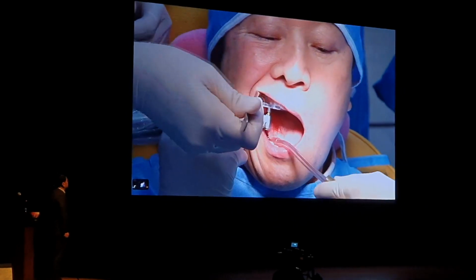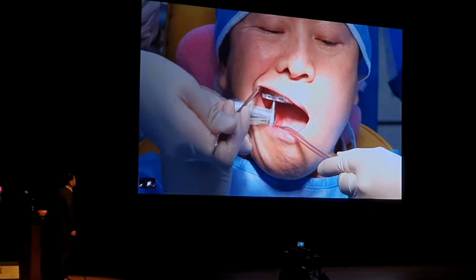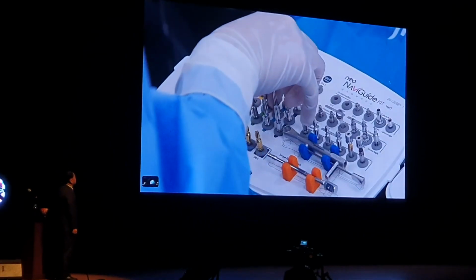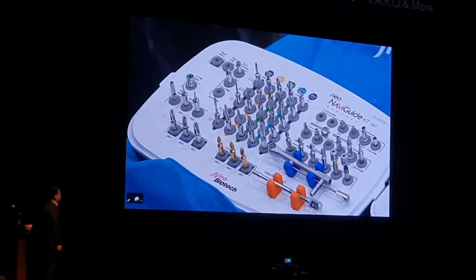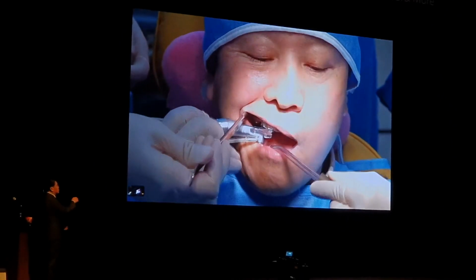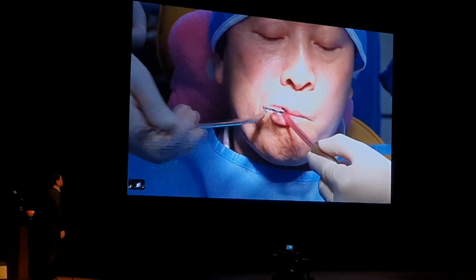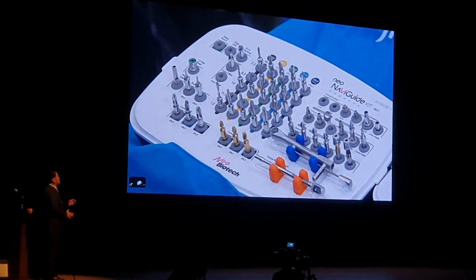Now we need to further continue the osteotomy site. He's using sequentially wider drills to slowly widen the osteotomy, incrementally widening it with the drill. Now the regular size final drill, 4.0 by 11.5, is being drilled. The sequence of drilling is in L-shaped order: first achieving the optimal depth, then widening the diameter. Correct. The VARO guide is perfectly stable inside the mouth.